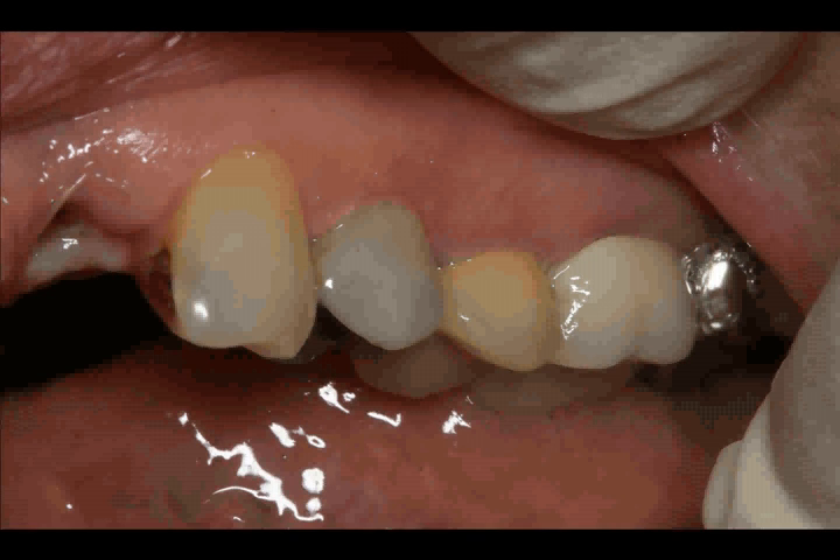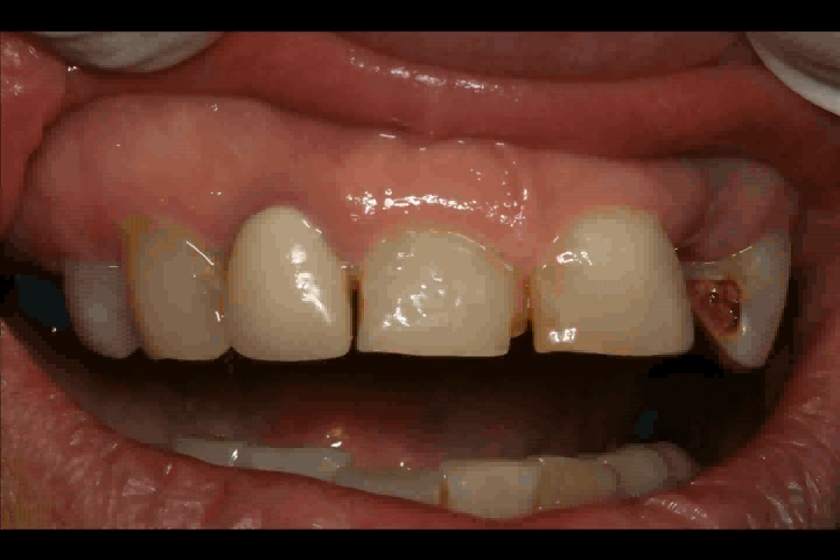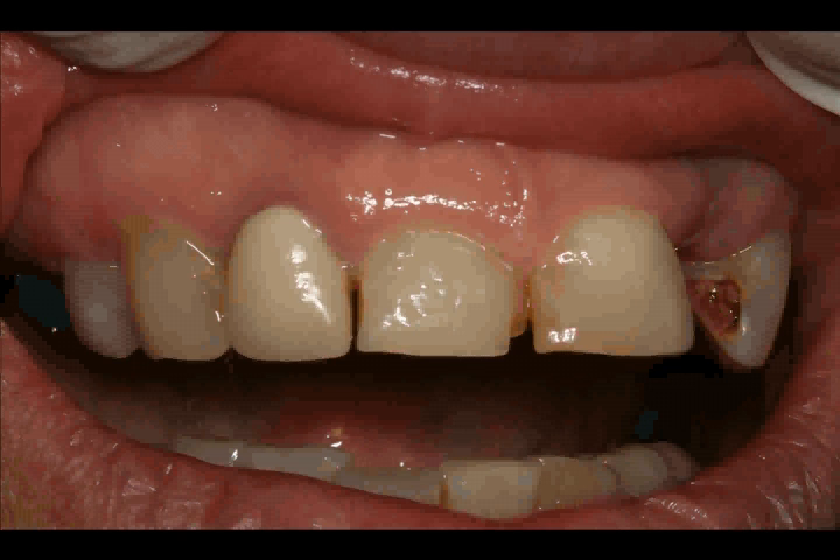One week later, we just showed the microscopy of the sulcus. But it's amazing how good the tissue looks one week after. If we did full periodontal surgery on this patient, she would be in pain for two weeks. However, when we do a laser treatment, even though we removed the gingival sulcus, this patient was comfortable the next day and the tissue looks this good one week later.